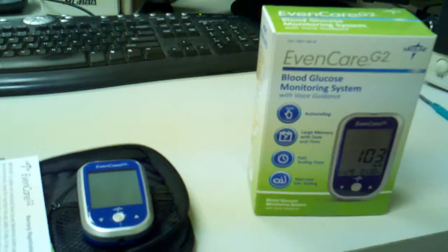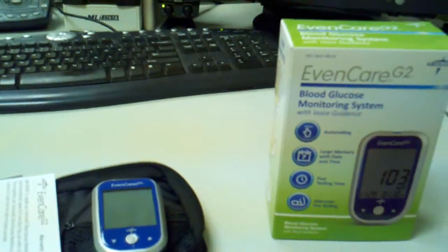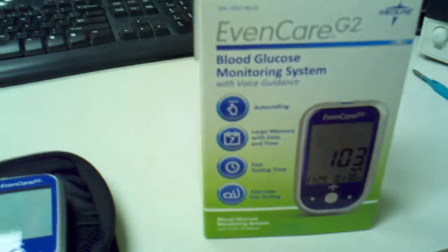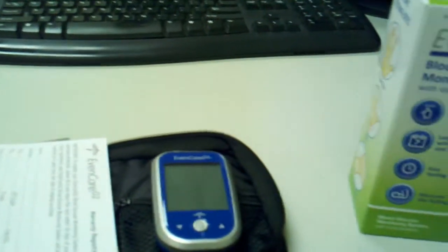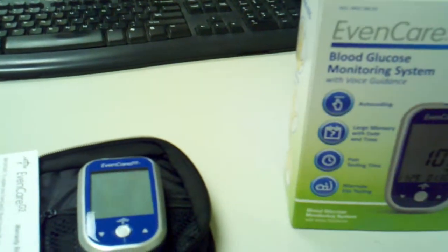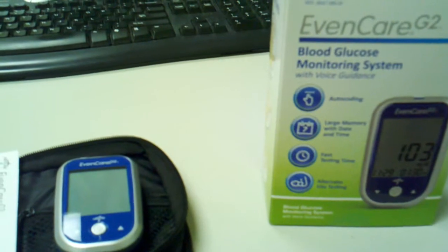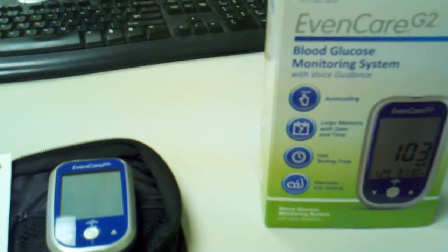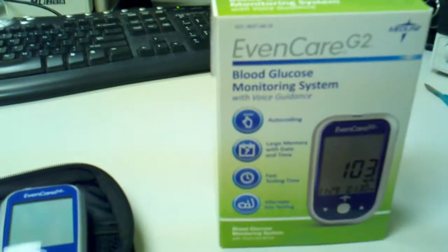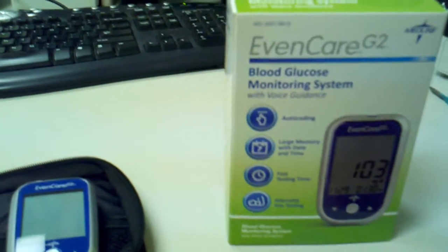Hello, you are looking at the brand new EvenCare G2 by Medline, and we distribute this on our website. We are going to be running a promotion on this where when you buy a certain amount of strips — check our website for details — if you buy three, four, five, or six boxes, you get this free.